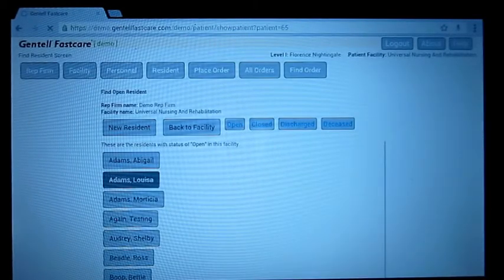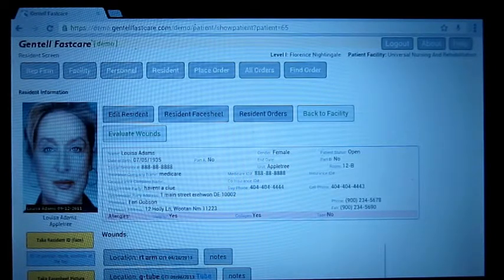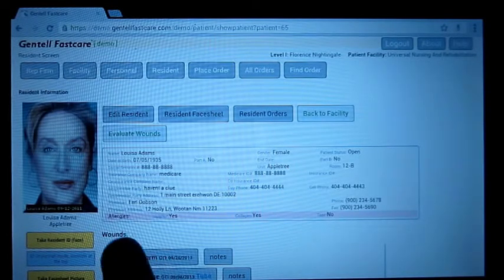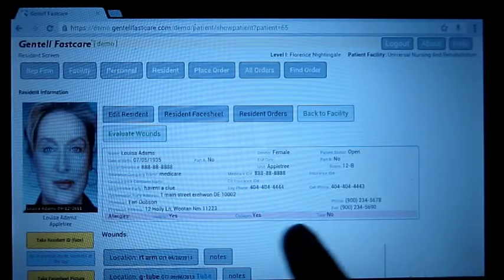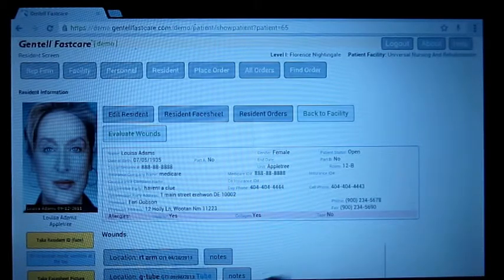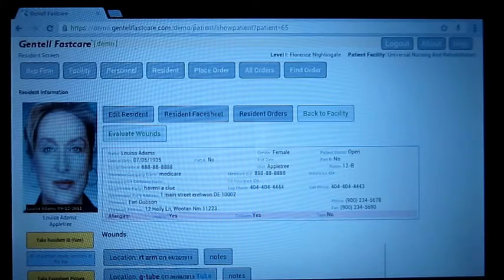Let's take a look at Louisa Adams. One of the things you might notice about this screen is that there is a little pink bar here that says allergies. It's not all the allergies, but these are allergies that might have to do with wound care products.